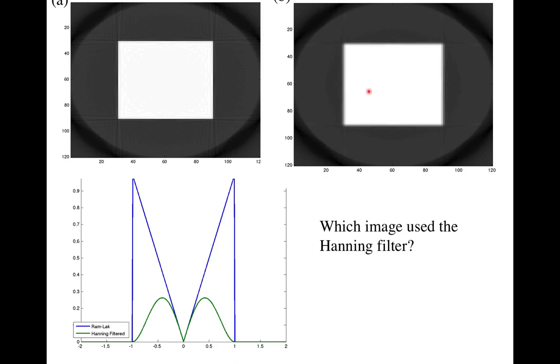So we already saw that you have this very nice sharp edge with the ramp filter. If you wanted to know precisely where that thing is and measure it cleanly, then it's probably okay to have this. There are artifacts here in the background. And then it gets smooth to a more sigmoidal shape when you apply this. So if I have a profile here, it's going to be a sigmoidal function.